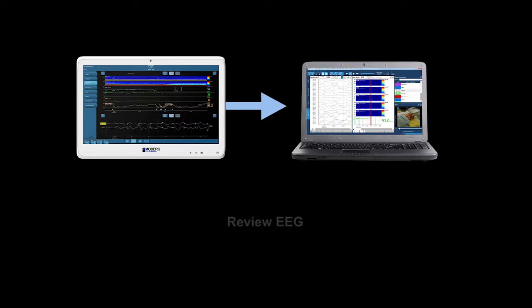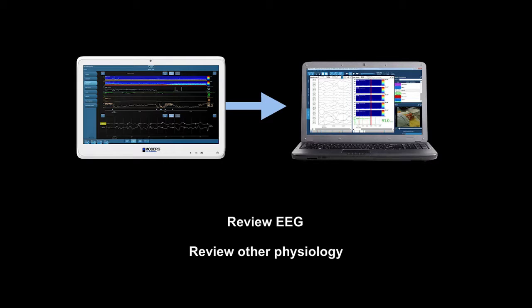Use the CNS reader to review, annotate, and generate reports with EEG and other physiology recorded with the CNS monitor.